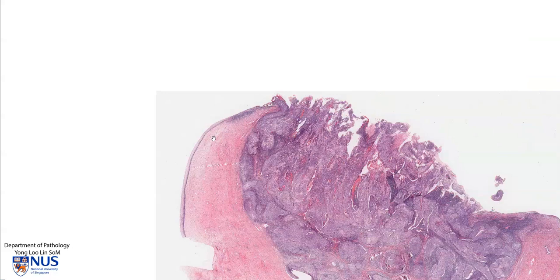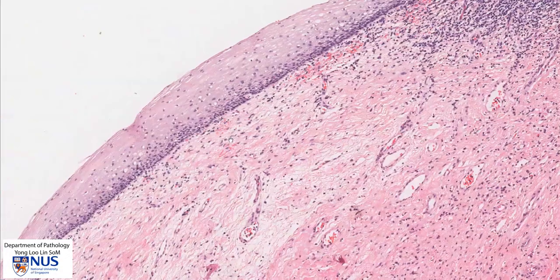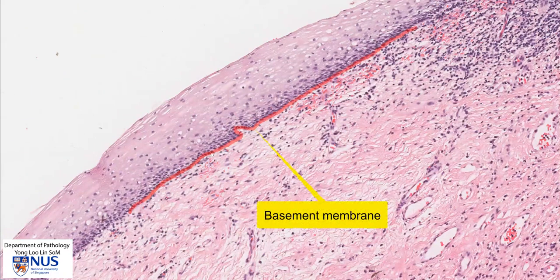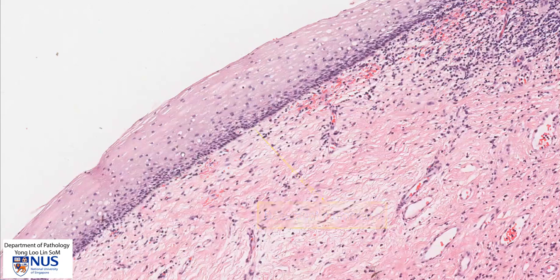Let's have a very quick recap of the stratified squamous epithelium of the normal ectocervix first. So here we can see the normal ectocervix, and this is the basement membrane. We can't really see it, but we can tell that the epithelium is very regimented and forming a line beyond which it does not go. So this is the basal layer of the stratified squamous epithelium.